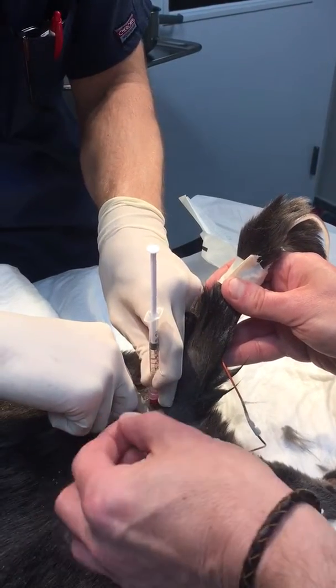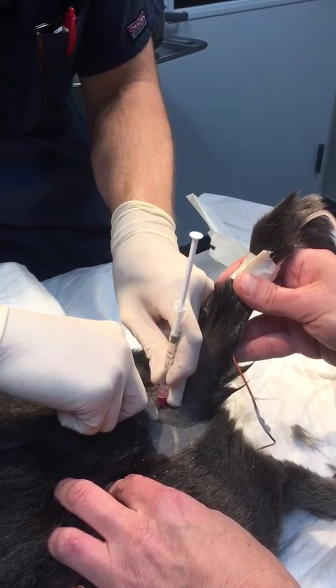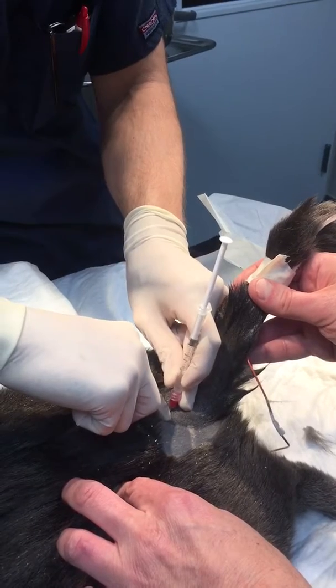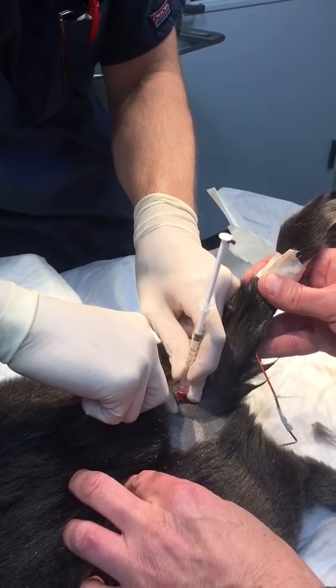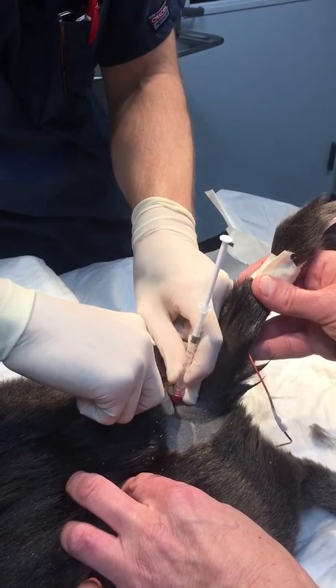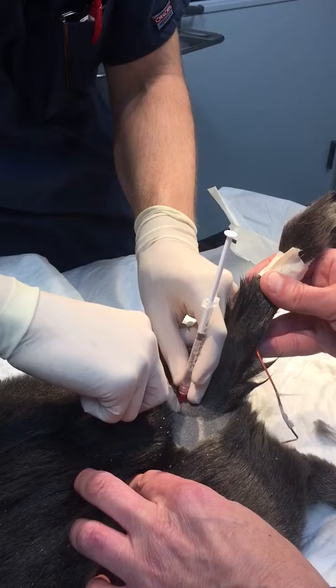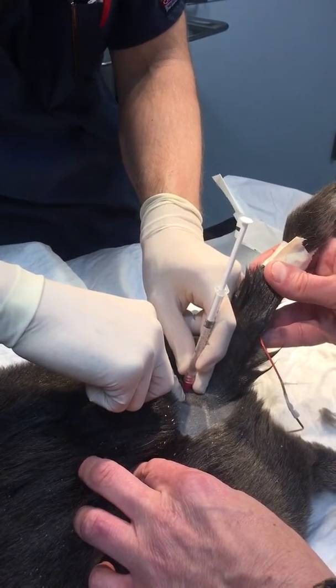Okay, then walk off caudally or cranially — it's hard, but you'll figure it out one way. Walk it off just the tip until we pop through.